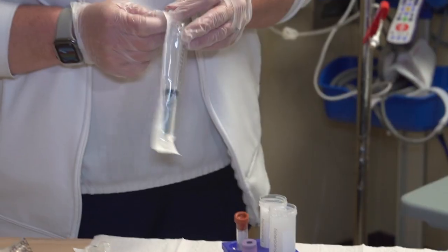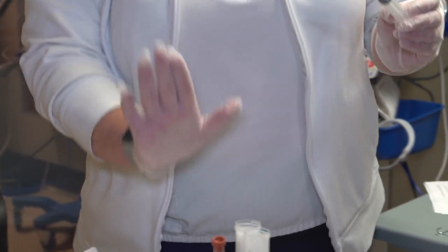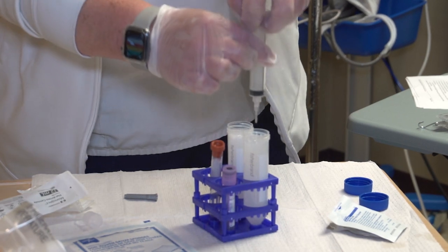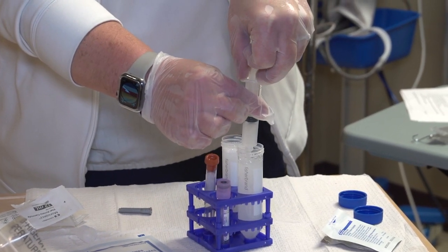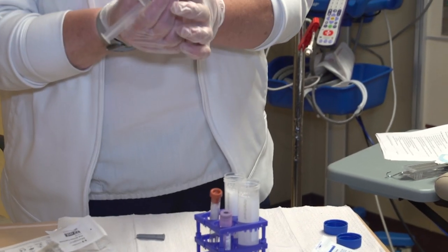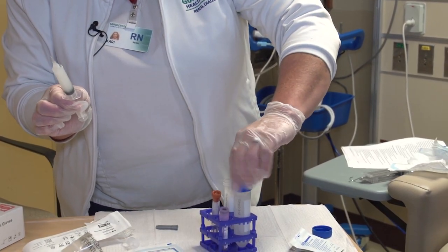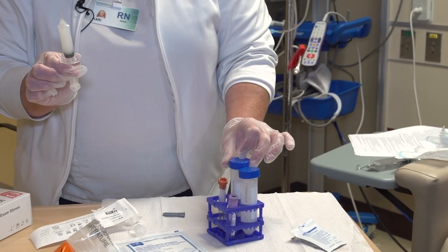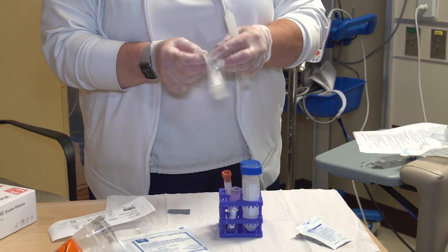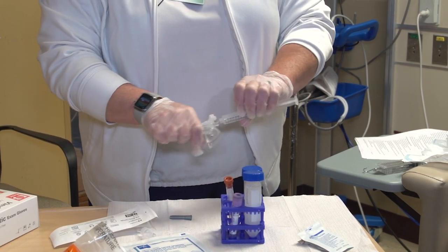You'll take a 12 or 10 cc syringe with a blunt tip needle, and you're going to take between 4 and 6 mils from each Falcon tube aseptically. And then replace your caps without touching. Tighten those down. You can change out your blunt needle to a sharp needle if you would like.